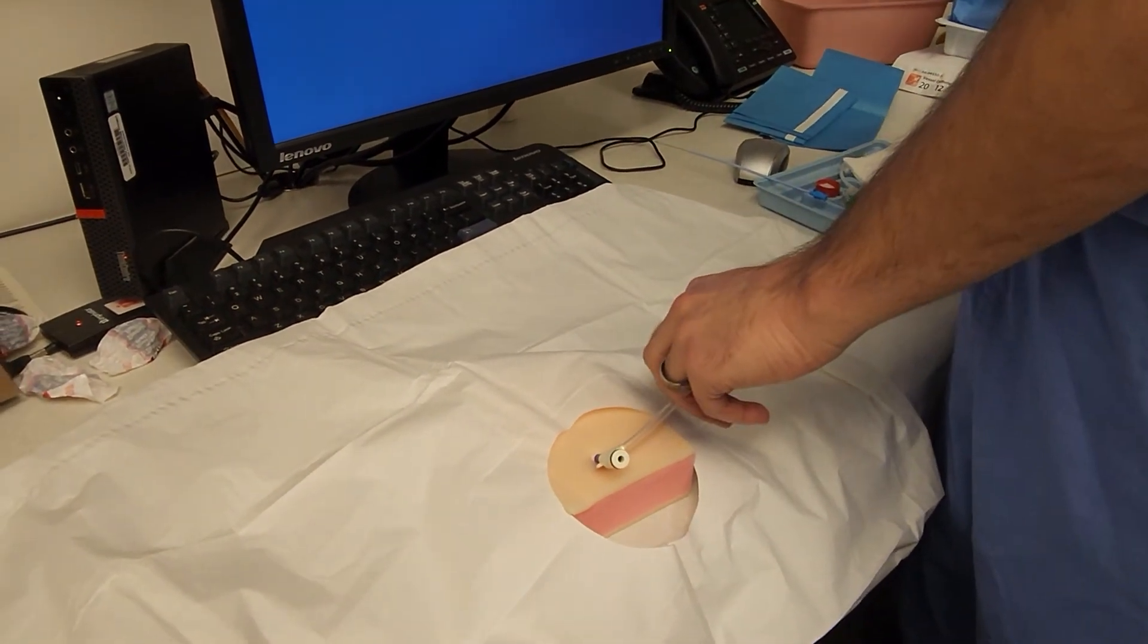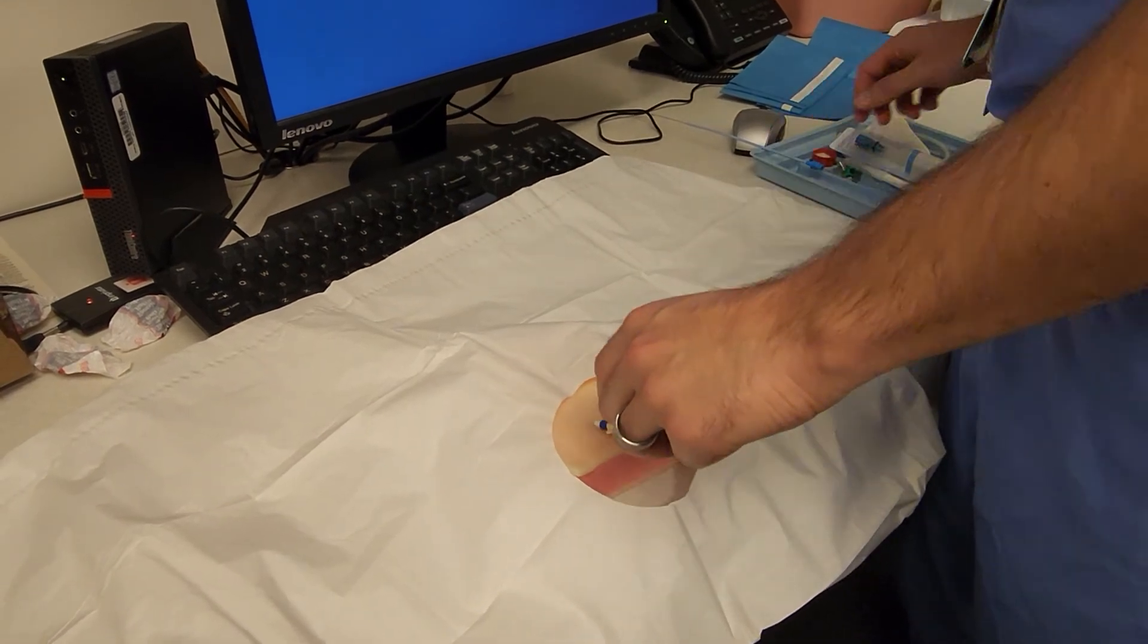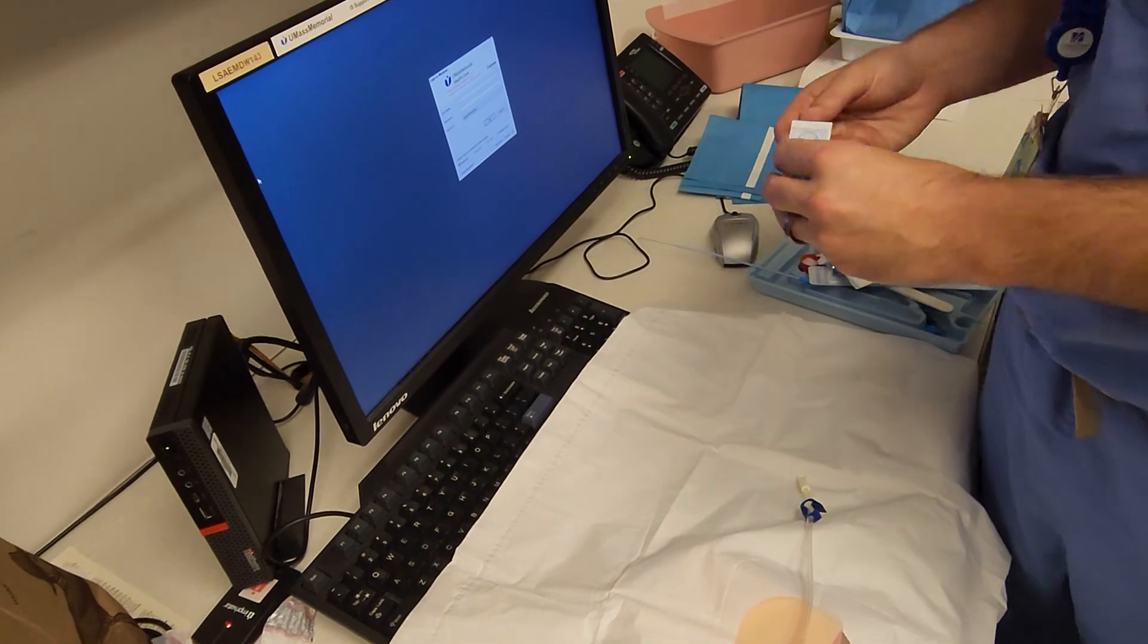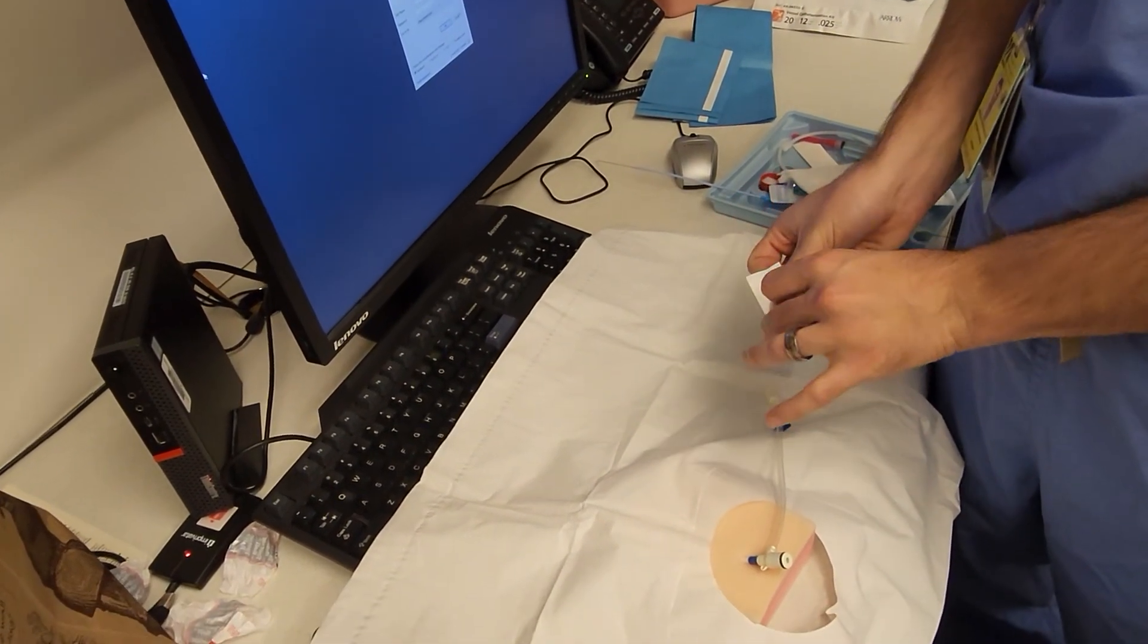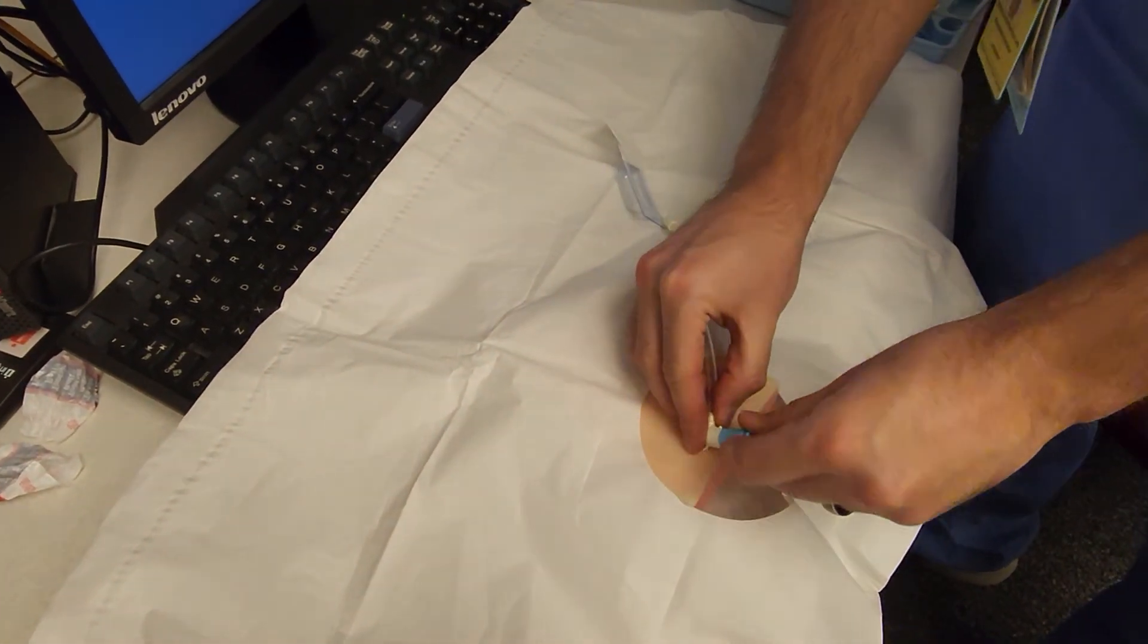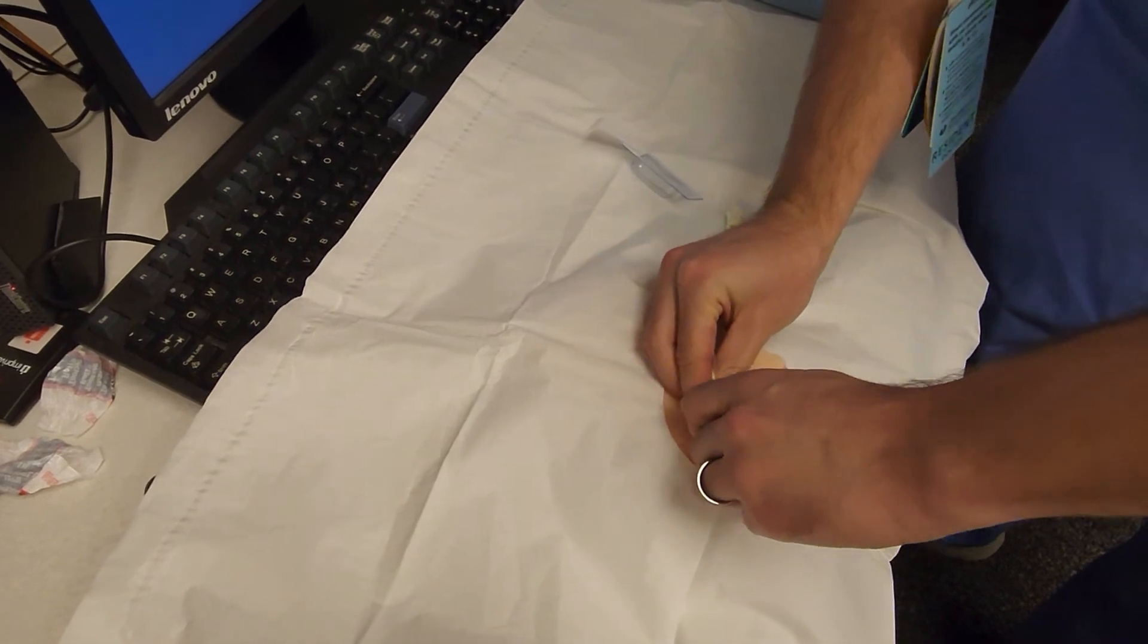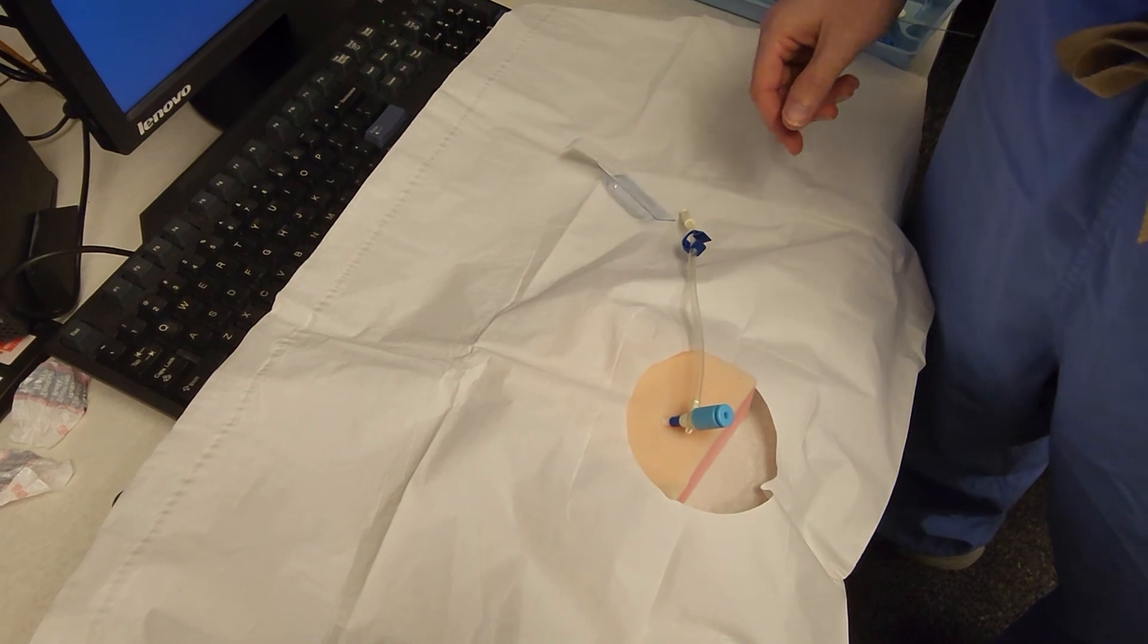And then the last step with these, after suturing it in place here, is to put this little cap on the end to keep it sterile. So this test goes on like that. And that's it.